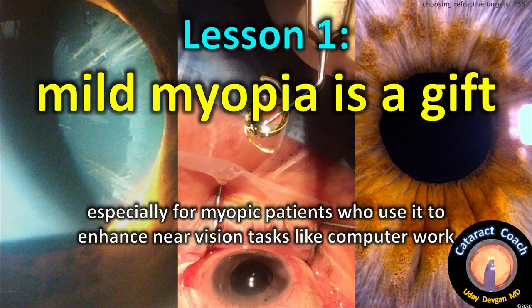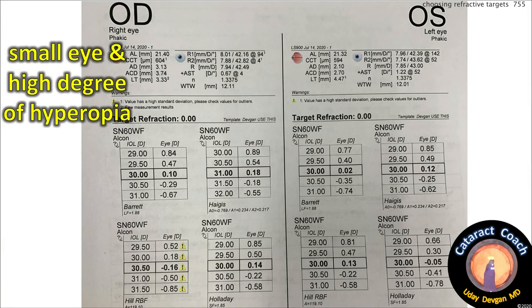Lesson one: mild myopia is a gift, especially for myopic patients who like to use it to enhance near vision tasks like computer work. Here's our next patient: a small eye with a high degree of hyperopia.